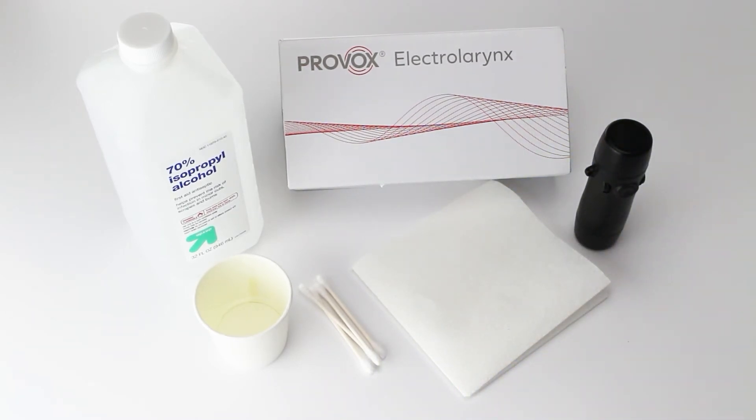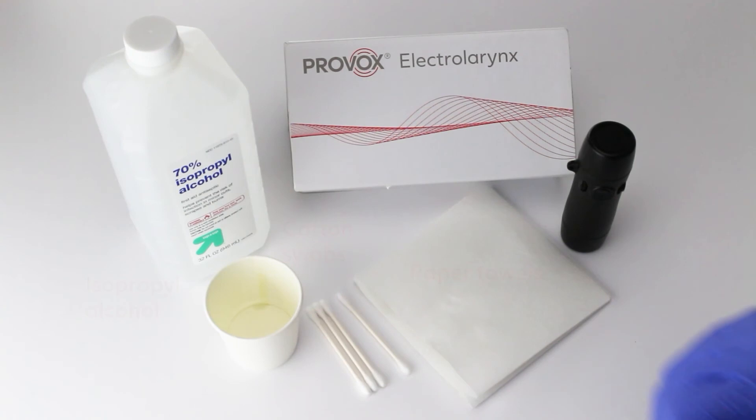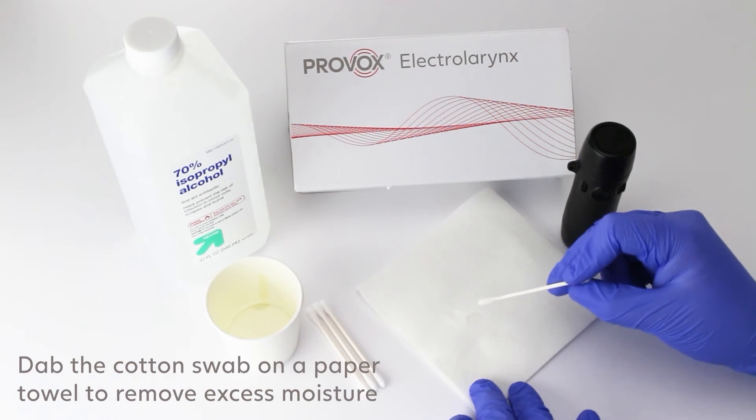One way to alleviate a sticking button is to clean it with isopropyl alcohol. You'll need the following items to clean the button: isopropyl alcohol, cotton swabs, and paper towels. First, dip a cotton swab in the isopropyl alcohol. The excess moisture should be dabbed onto a paper towel to prevent moisture damage.